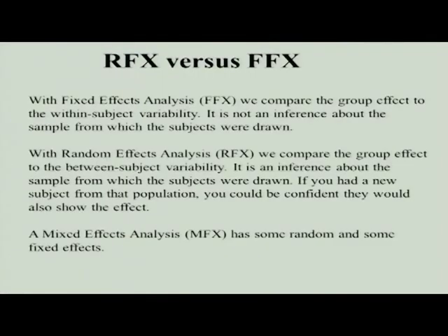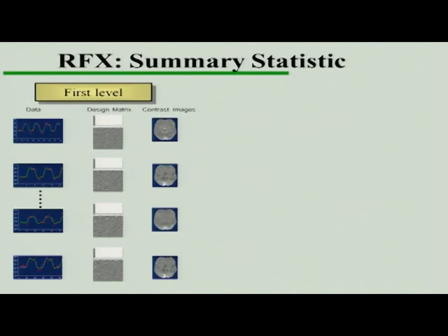Okay. So everything I've talked about so far was just for one voxel in the brain. It's completely straightforward. All you do is you get the summary statistic from each subject, which is how big is the effect, and then you do a one-sample t-test. But of course, we've got images. We don't just have single time series, we have brain imaging time series. And so we just apply exactly the same procedure, but voxel by voxel at every point in an image.